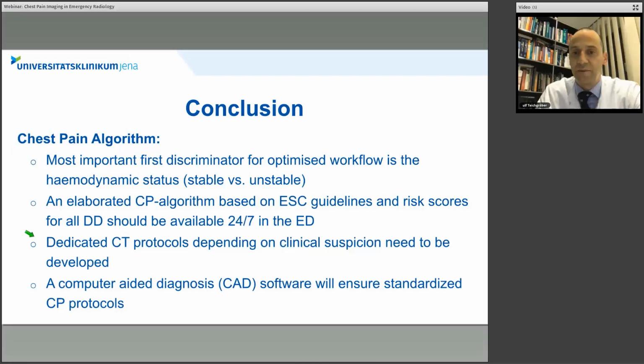How many radiologists in your department can evaluate stenosis and coronary arteries? Oh, good question. Also at the beginning, it's actually my residents who are doing it first. So the reconstruction and the first interpretation is done by the resident, but every report before it goes to the physician should be seen by the attending on call. This is what I recommend.